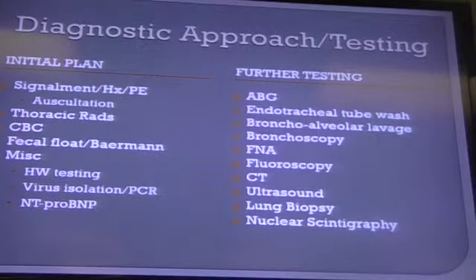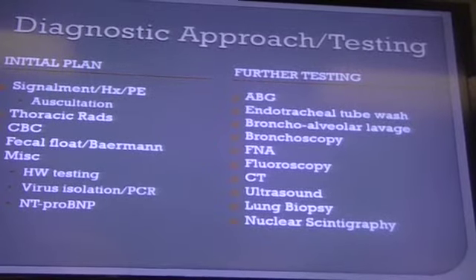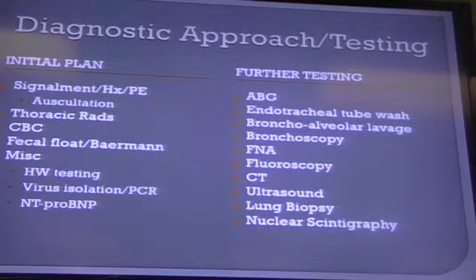I may do airway washes, so you can either do one down the ET tube, that's going to be a little less invasive. I like doing bronchoalveolar lavages, that's going to get me more of what's happening on a cellular level in the lower airways. I can do bronchoscopy and see what's happening. Am I seeing lower airway collapse? Am I seeing inflammation? Are there nodules or growths or something that is of concern? I can also do my airway wash using my bronchoscope.